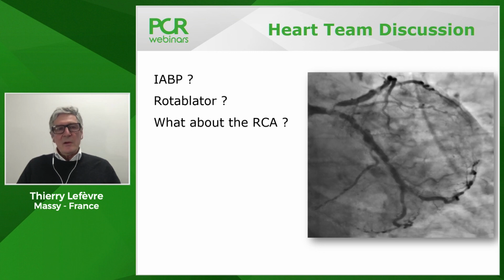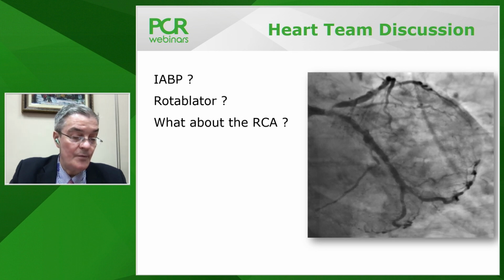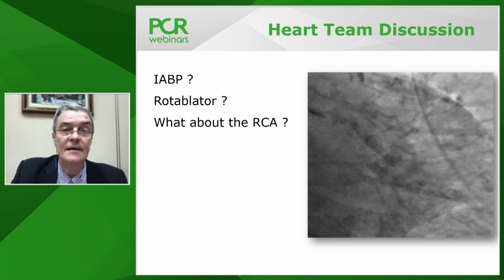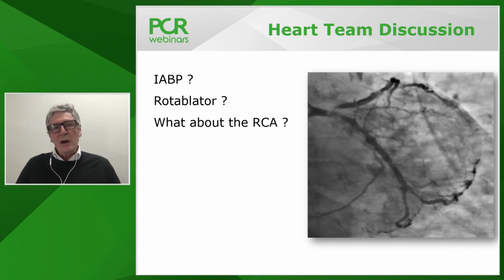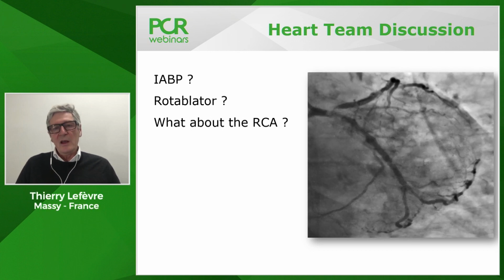You have a very high diastolic pressure elevation with a balloon in this kind of patient. Another question was asked by Dr. Binayak Deb, about pre-procedural imaging to see the extent of calcium. I think Prof. Tan already commented. So please proceed, Thierry. Yes, I will comment on that, because I anticipate that it will not be safe to use intracoronary imaging in this particular case.